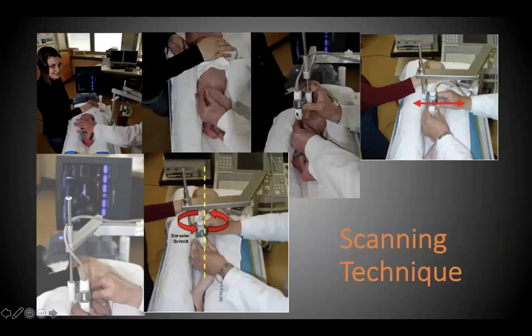So there is a very particular technique that he describes of doing the ultrasound scans, wherein the child is placed in the lateral position, and you use the two fingers of your hand to palpate the trochanter. You put the jelly of the ultrasound between the two fingers, not on the probe as we routinely do, and then the probe is brought down from the top between your two fingers, pushing the two fingers apart, as you can see here.